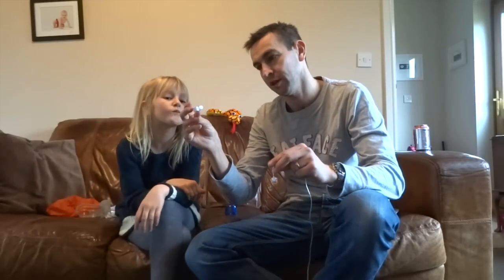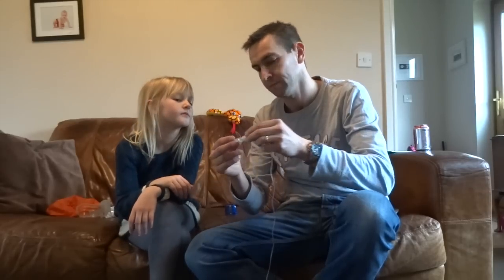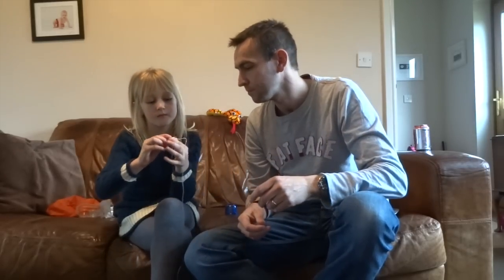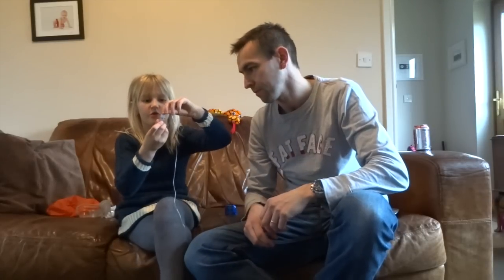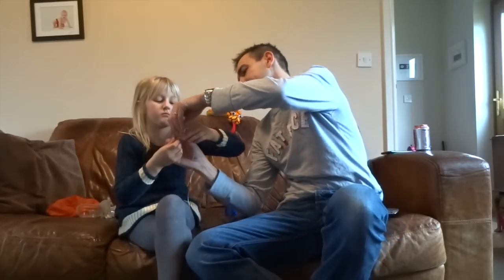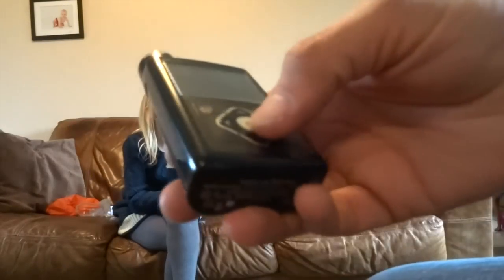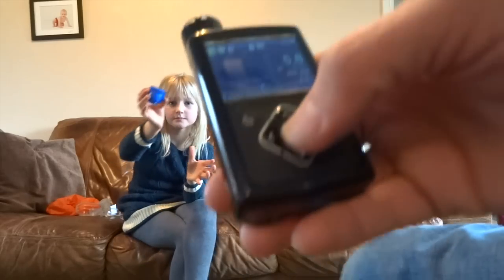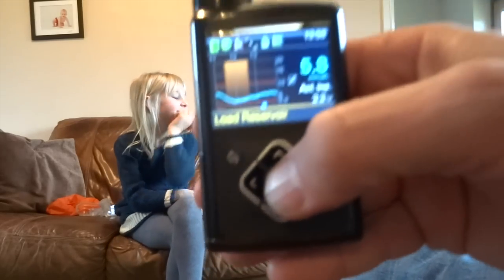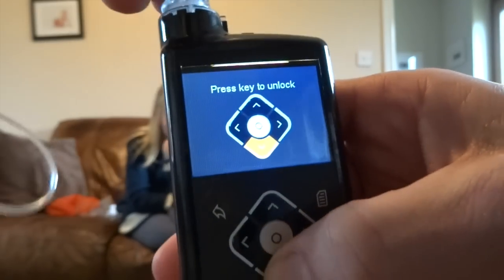Next, we connect the reservoir, which we just filled, to the set. You do that, and then you twist it to lock it. So that's all set in. We now need to put this into the pump. It will give me a helpful message — Load Reservoir. So we click the button to confirm. We need to unlock it as well.